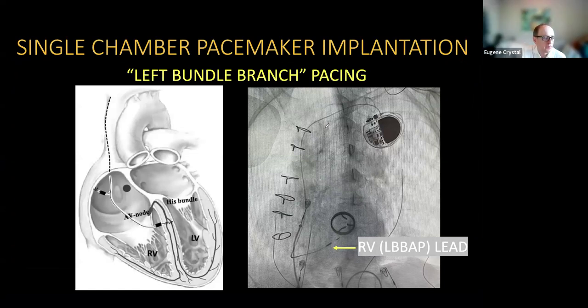Thanks. So again, it's a great presentation, and I do think that the fact that you will go with AV junction ablation makes you the only game, right? And so you have to try to achieve the best possible results. It's also a good case to comment on His bundle pacing versus left bundle branch pacing, right? That allows you additional levels of safety, right? During AV junction ablation, His pacing may become unreliable. And second, His pacing may become unreliable over time, right? You actually can lose capture in this area, as Deepak commented earlier. So I will stop here. Deepak, anything on your side?